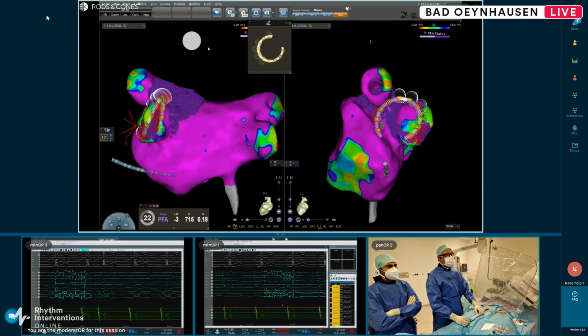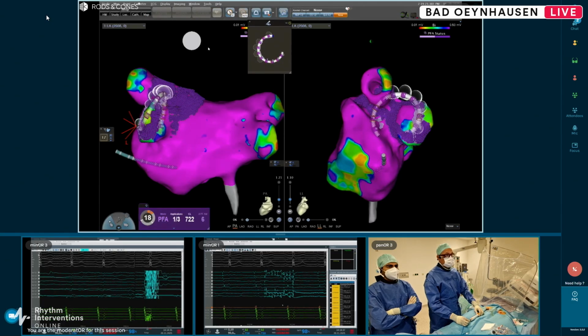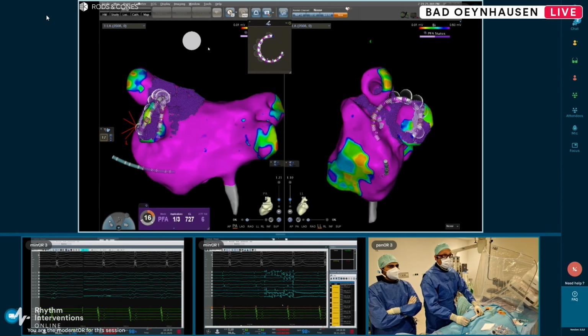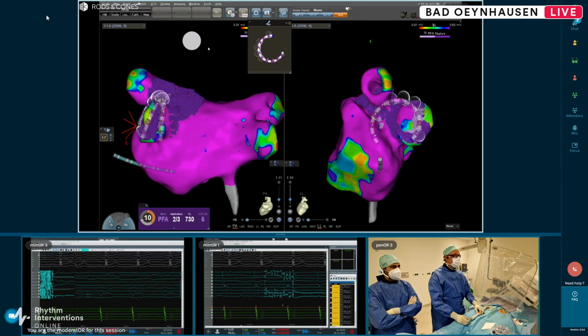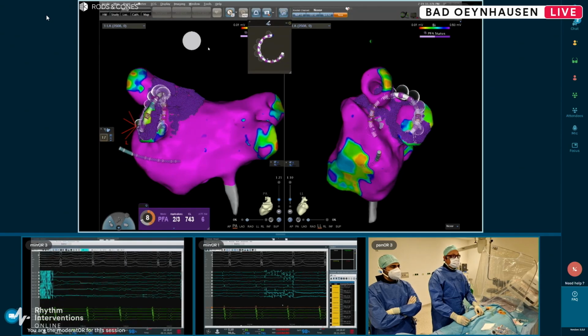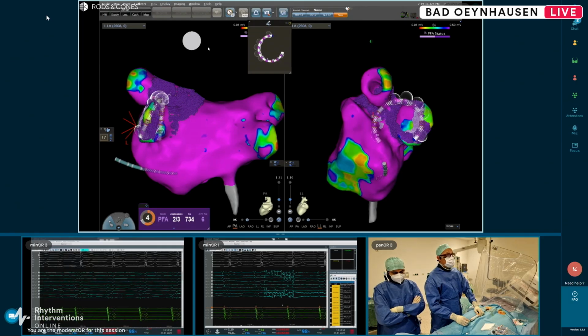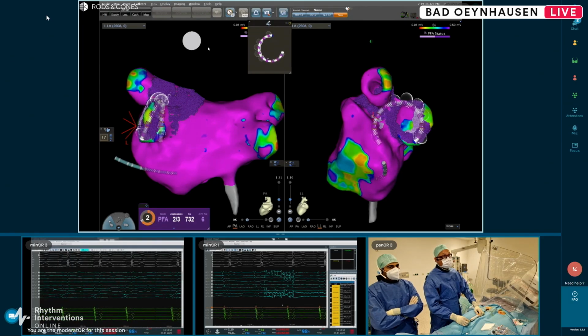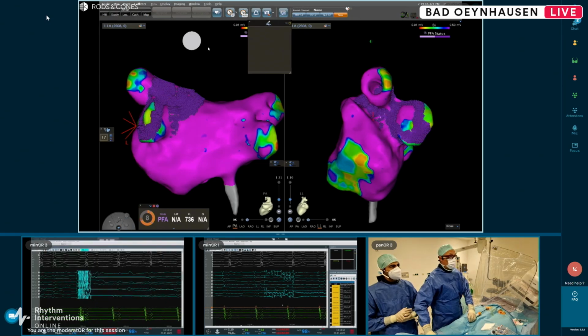And when you look at the right side, you can again see that in this posterior orientation, we have very good TPI. Whereas on electrodes 10, 9, and 8, I would say the TPI is limited. You can also deactivate them, but 10 has now good TPI. So yeah, it's always a question of the TPI. Normally we try to get 12 out of 12 if it's possible.